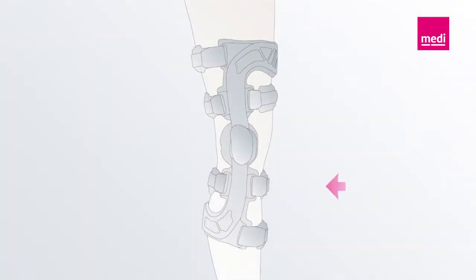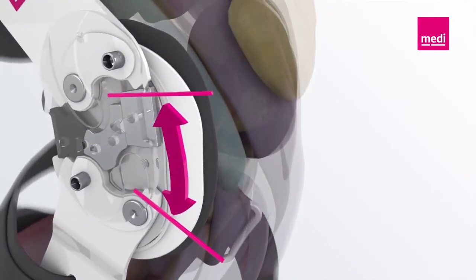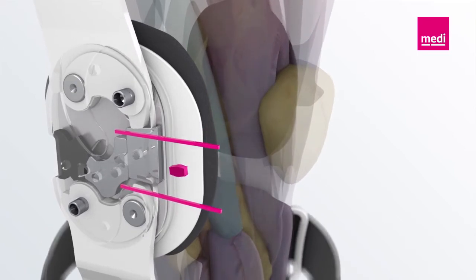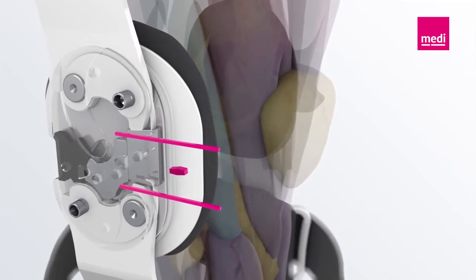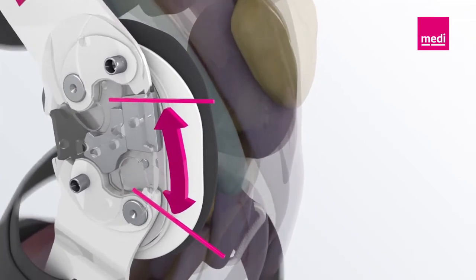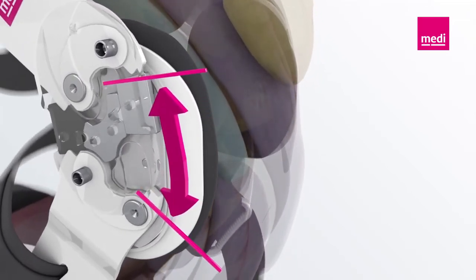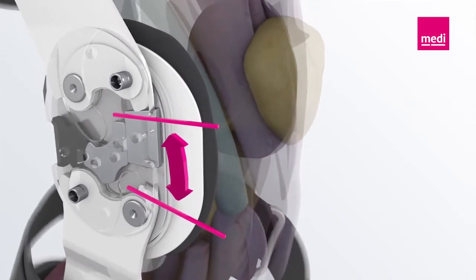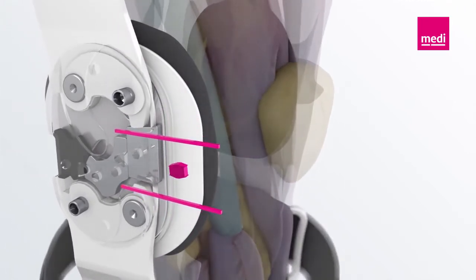The sophisticated frame system ensures optimum stabilization of the knee joint based on the four-point principle, after rupture of the anterior cruciate ligament. The Physioglide joint imitates the rolling gliding movement of the knee joint to guarantee that the orthosis fits perfectly. The additional option of limiting extension and flexion protects the affected knee joint from damaging movements and thus maintains the patient's treatment status.